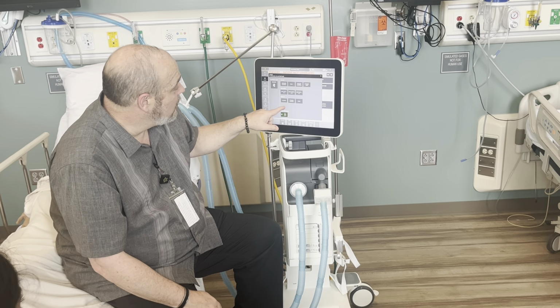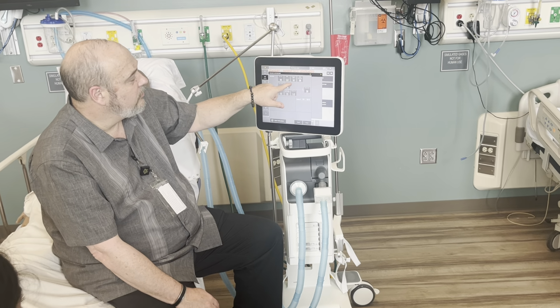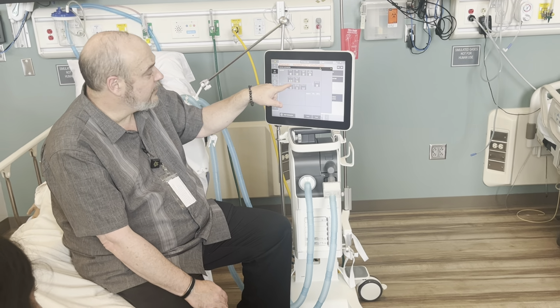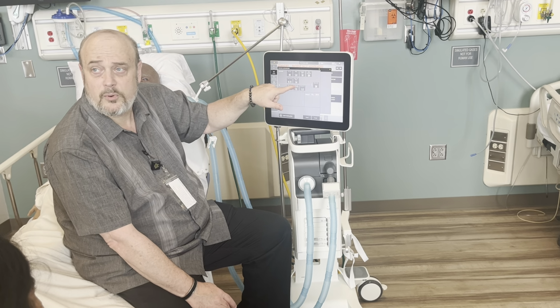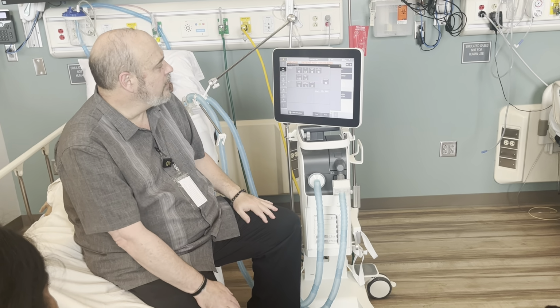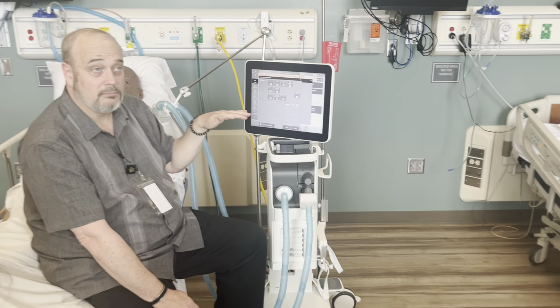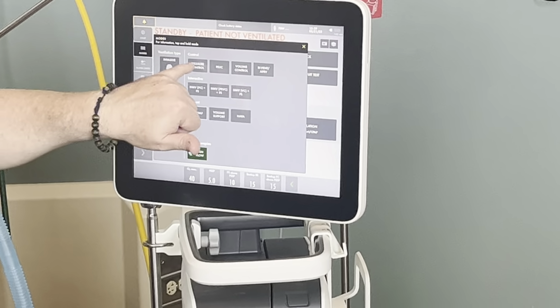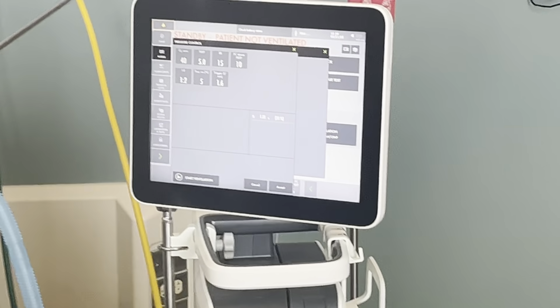Okay. So we've got CPAP, pressure support. I've got 40%, 10/5, 30. That's my end expiratory. We'll go over that another day. Unless, did James already go over that with you? Expiratory cycle off percentage? You may have heard it called that. Okay. Well, we can go over that as well. You have a rise time and you have a trigger, and then you have a backup. Okay? So now let's go to pressure control ventilation. I have the exact same thing, but now I have a rate and an inspiratory time.